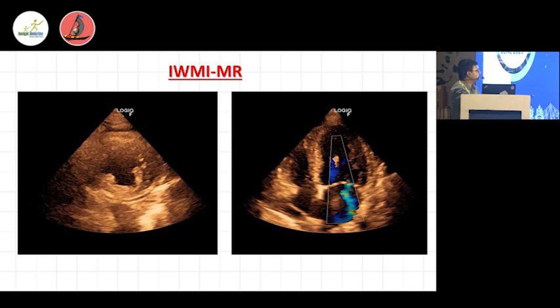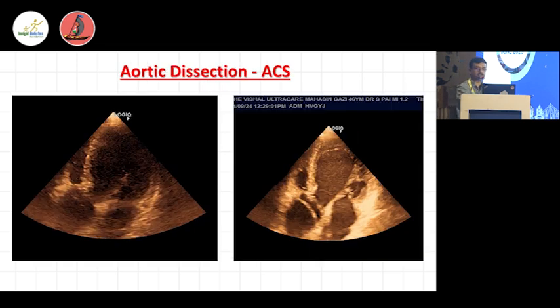Then subsequently T-wave recovery will be there, while the Q-wave will get deepened, and persistently, if there is an LV aneurysm morphology, we will get a deep Q-wave along with the persistent ST elevation with positive T-waves. And if there is reperfusion, then we will get some T-wave related changes, and ultimately there will be possibility of complete normalization of the ECG if it is timely reperfused.